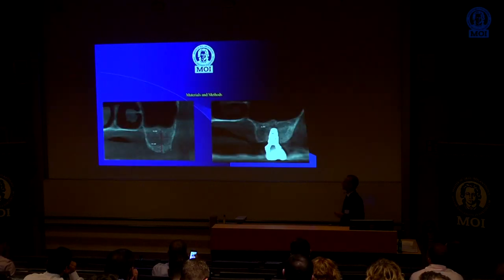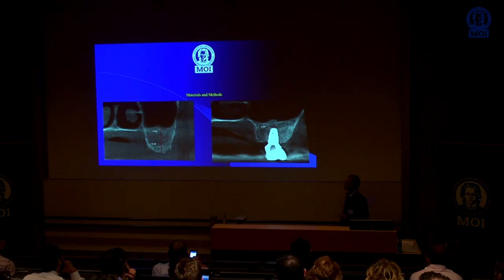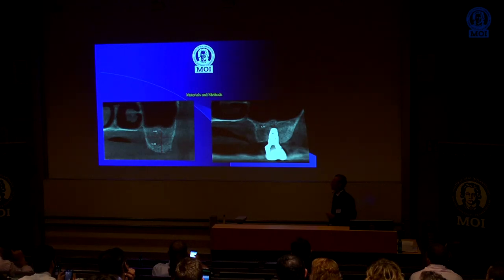The third parameter established was the bone on tip of the implant, in order to determine the proper length of each implant to be used. CBCT slices were used to measure the height of the available bone, and all implants inserted were 4 millimeters shorter to allow for bone remodeling under the load phase.